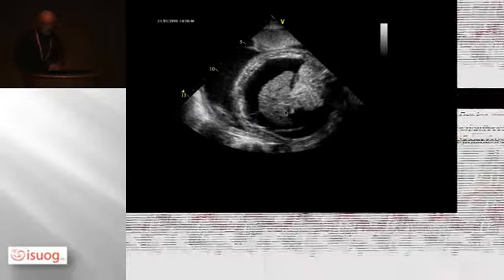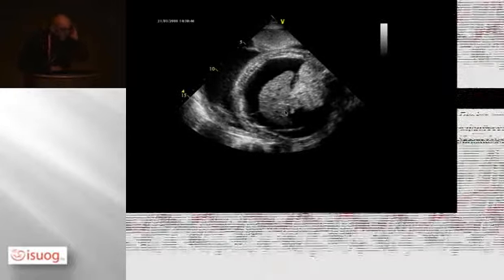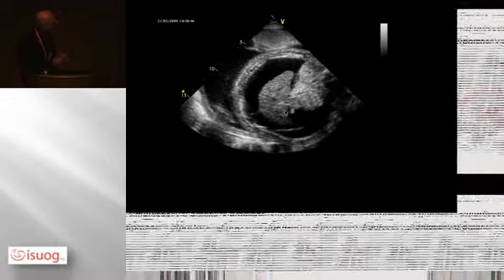Do you find anything wrong with this liver? Come on. Sorry? Coarse? Small. Exactly. It's small, it's rounded edge, and it's a coarse surface, and also a coarse texture. Why?